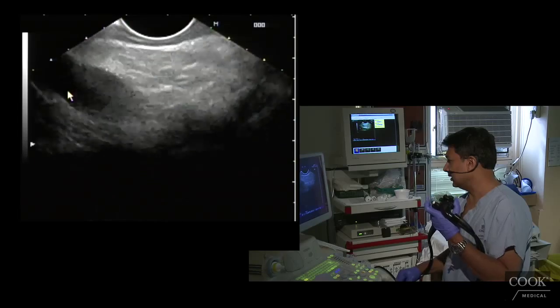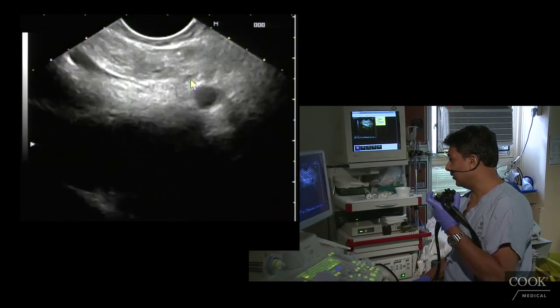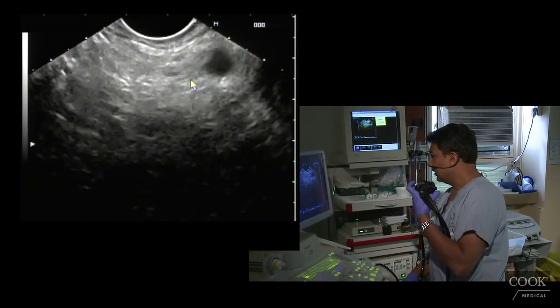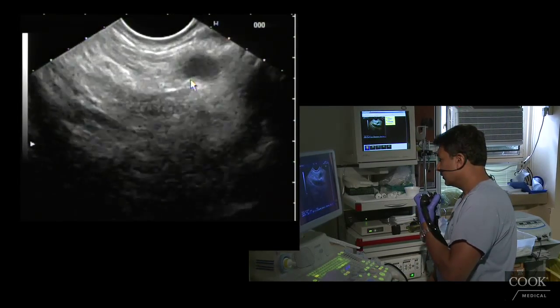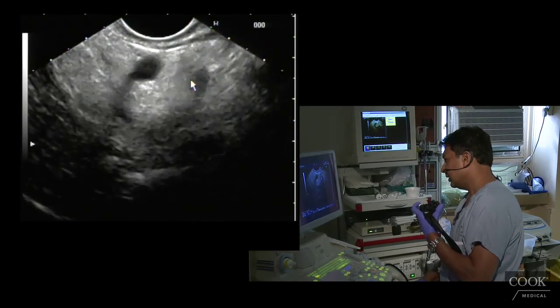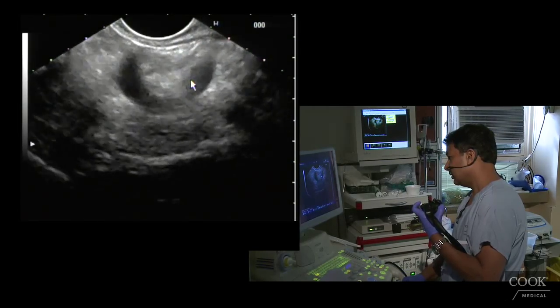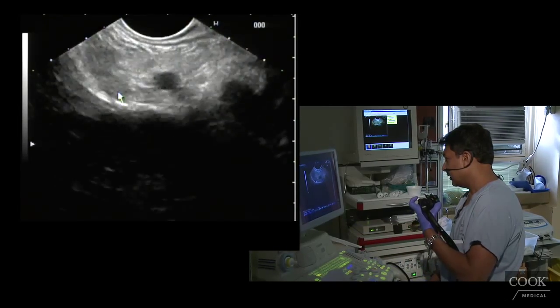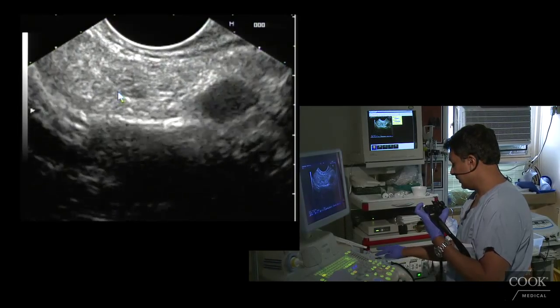So if we go out to the tail here, there's the pancreatic duct here, which is thin. And we follow it slow. Then it disappears a bit. No, there it is still. There it is. And then follow it. And then that's still not dilated. There it is there still, right here. Follow it there. And all of a sudden it gets big. See right there, it gets big. That's what was happening last time.